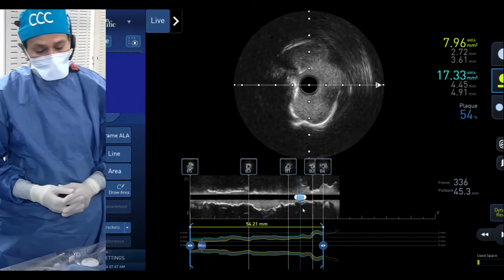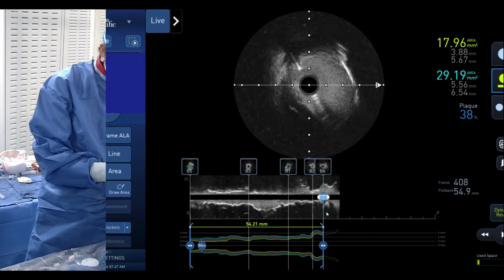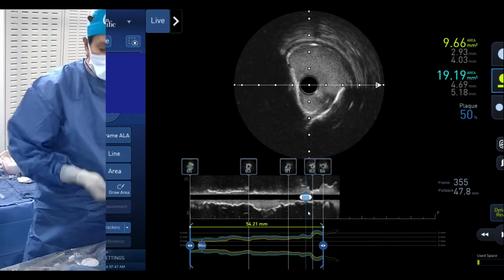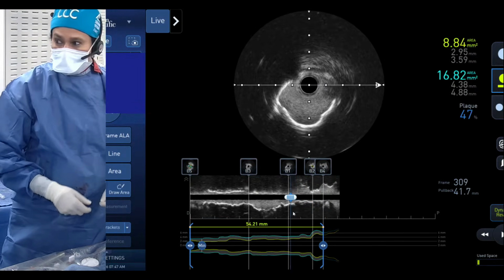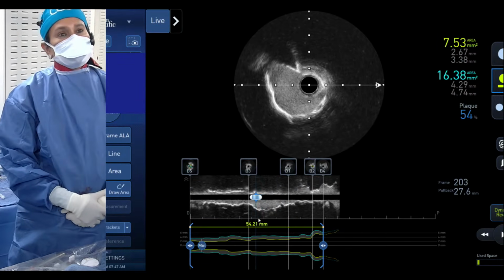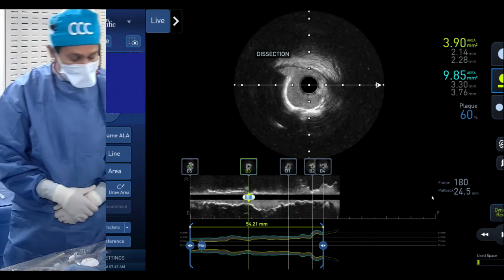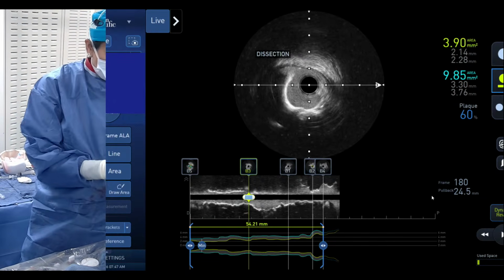That is difficult for us to come up with yet, unless you have done imaging multiple times. Give 3 pulses, image, give 6 pulses, image, and then we understand what each of these 3 pulses or 1 pulse is doing. That's really difficult to understand.